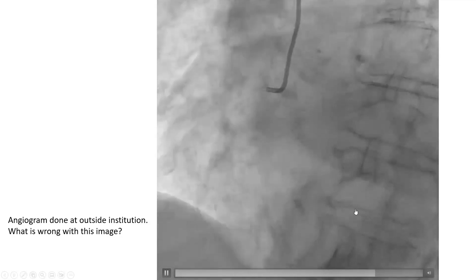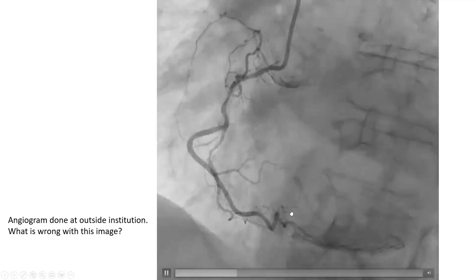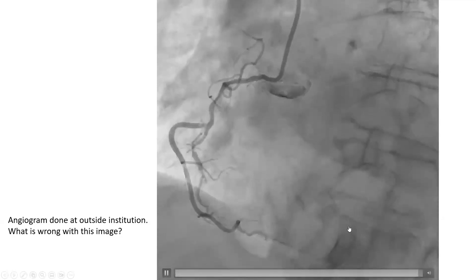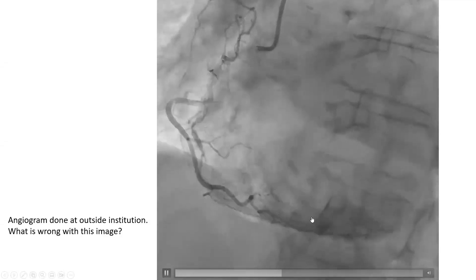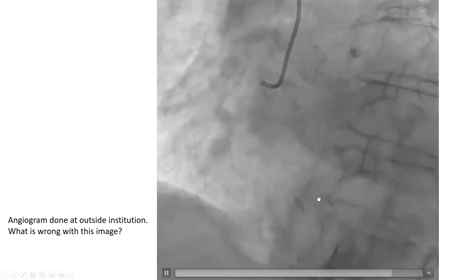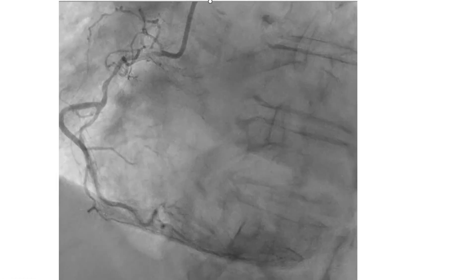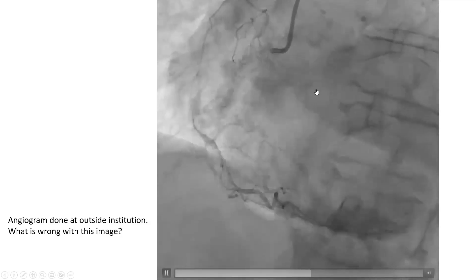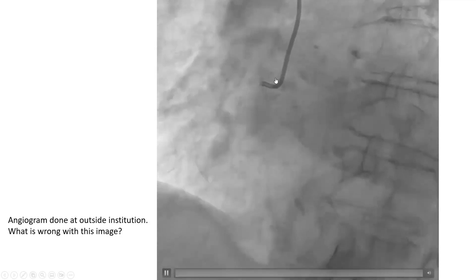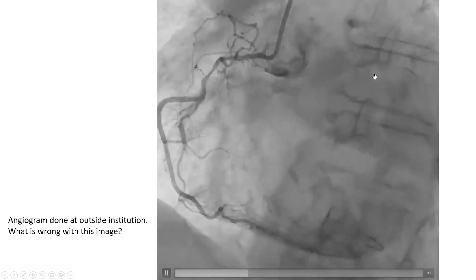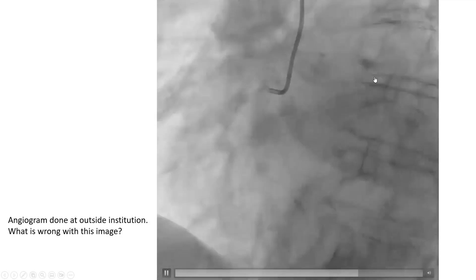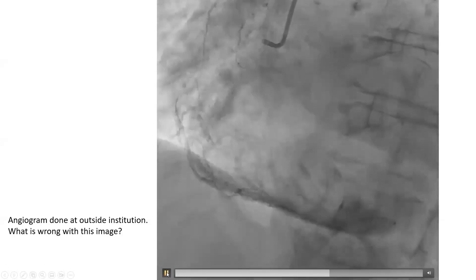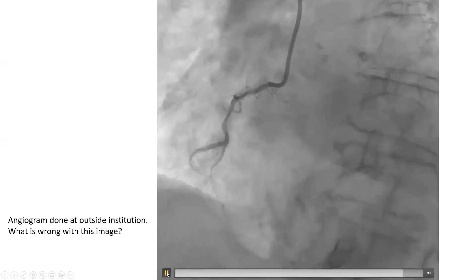The huge issue in this angiogram is massive myocardial blush. What you see here is contrast staining the muscle — the myocardium. This reflects what happens when you inject with a catheter that is occluding the vessel. The hemodynamics probably show damping or ventricularization. Just looking at this picture, this catheter is occluding the vessel — the catheter is bigger than the ostium and is therefore occluding the vessel.